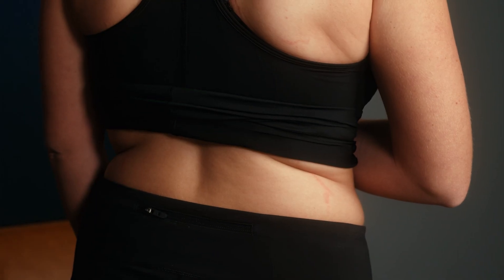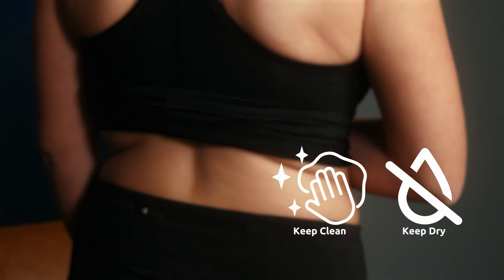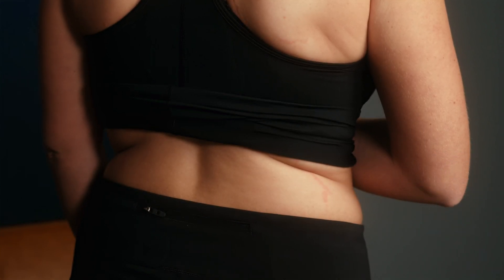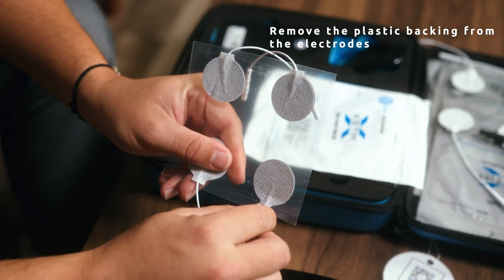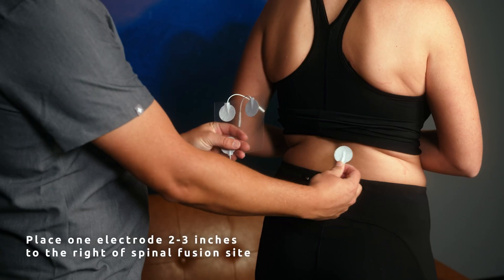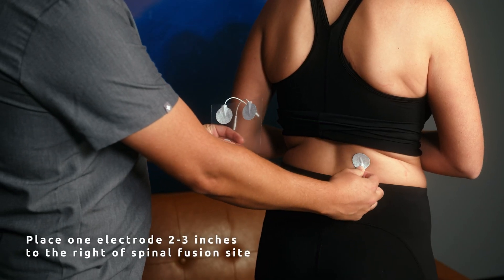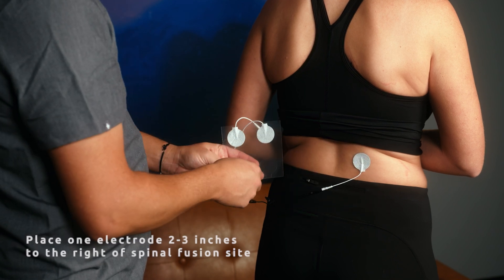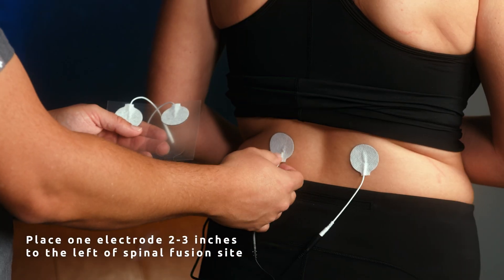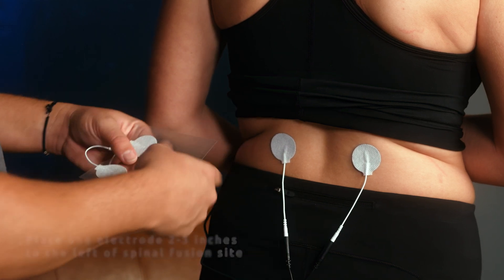Now let's place the electrodes. Clean and dry the skin where the electrodes will be placed. Trim any body hair if necessary. Remove the plastic backing from the electrodes. Place one electrode two to three inches to the right of the spinal fusion site and the other two to three inches to the left, ensuring they are four to six inches apart. If needed, ask for assistance to ensure correct placement.